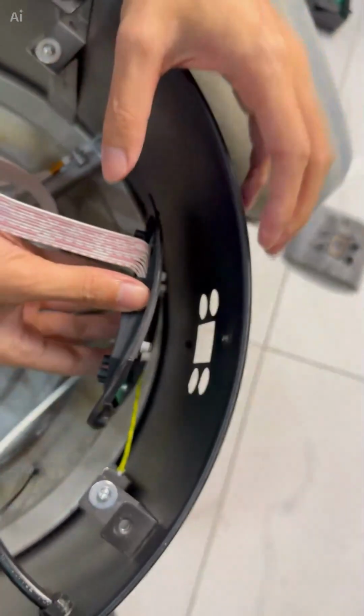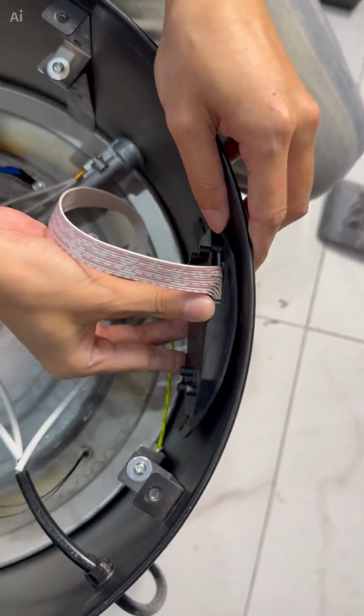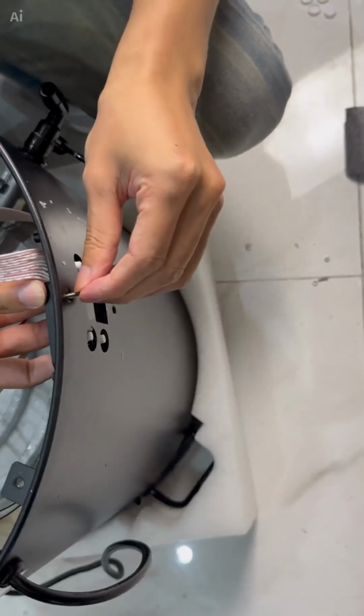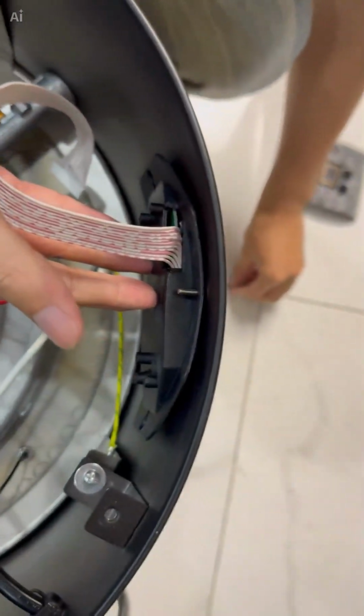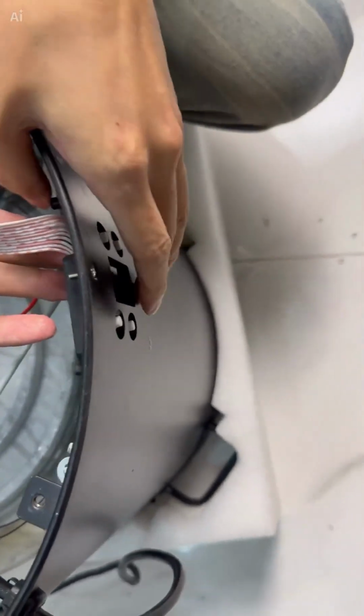Then I place it like this. Then take out the screw we just had. First tighten the screw, insert it into this. Okay, then do the same for the bottom. You can also tighten it from below.